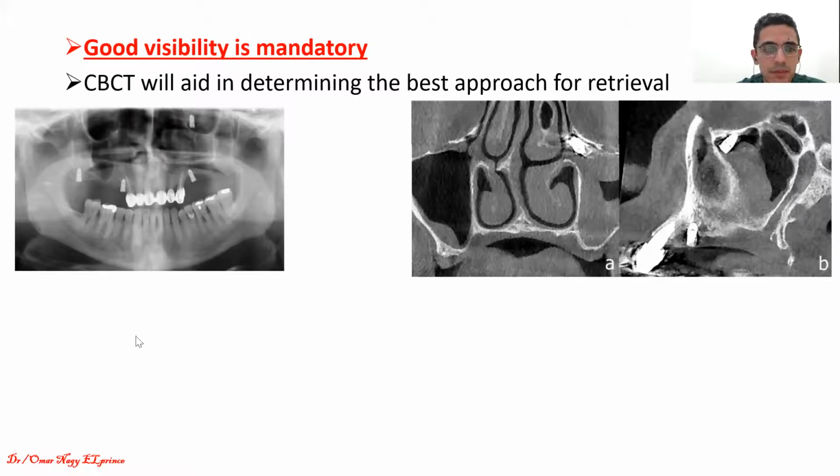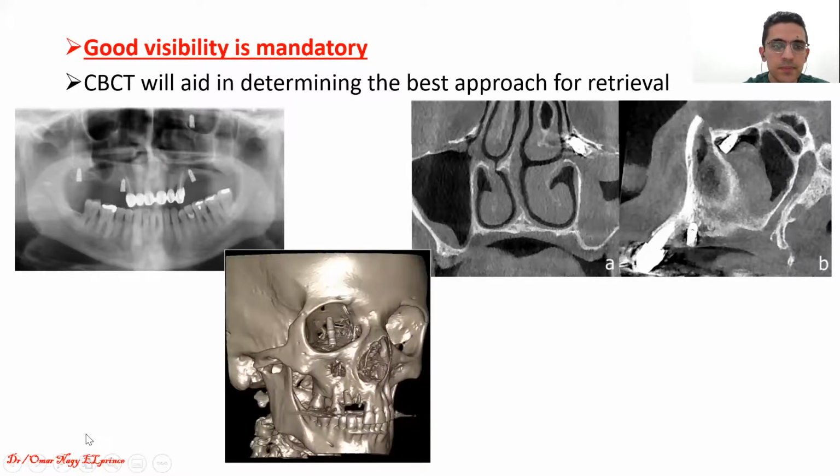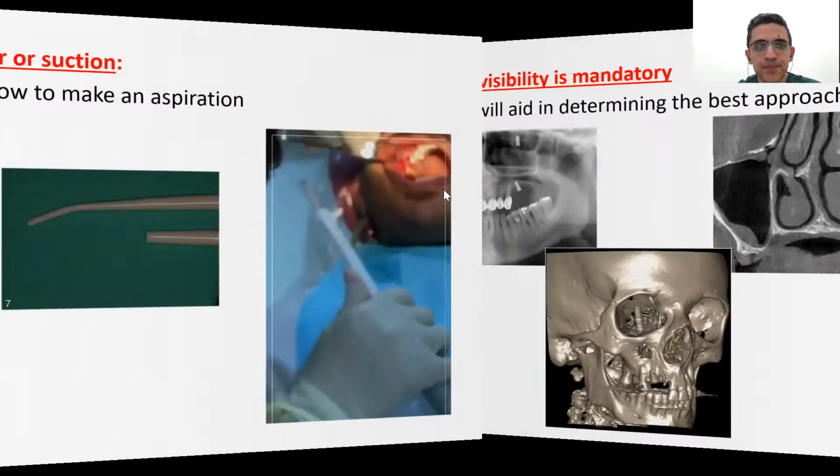And okay, so you can see here this is truly an implant in the eye, but this is not the same case as this one. This one is that case, but that one is not this. So you might end up with an implant in the eye, which is unfortunate. Actually, it might happen; maybe only one or two cases have been reported. It might happen, but you have to make sure. That's why you don't have to depend just on the panorama.